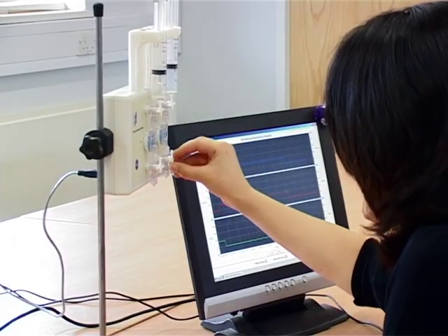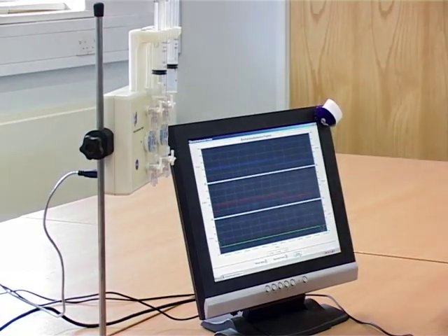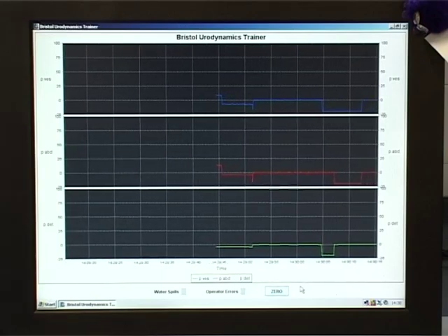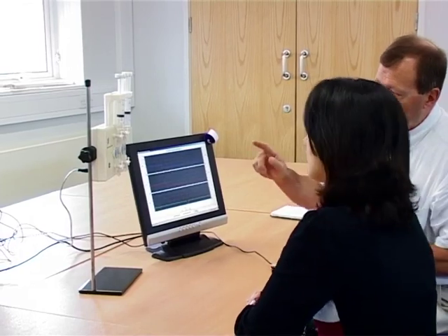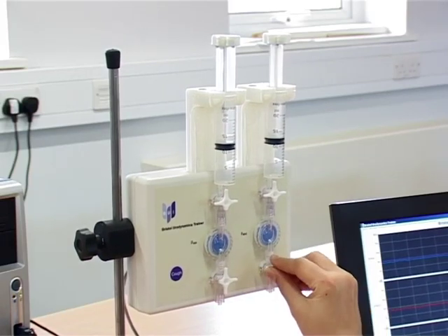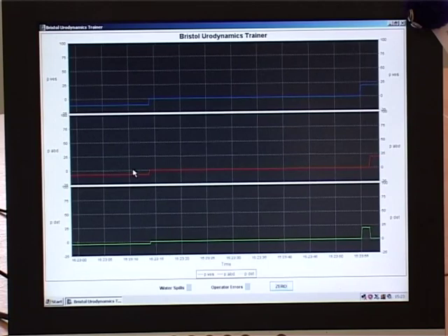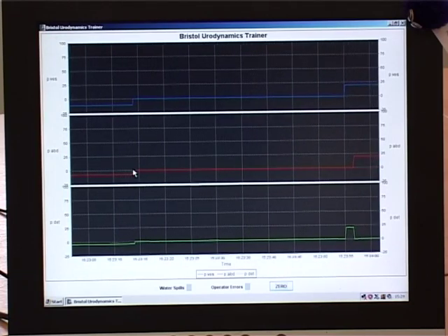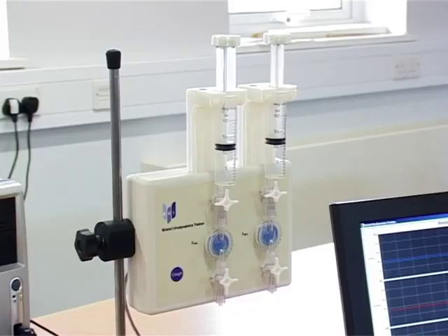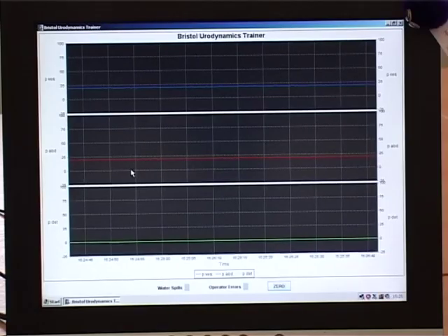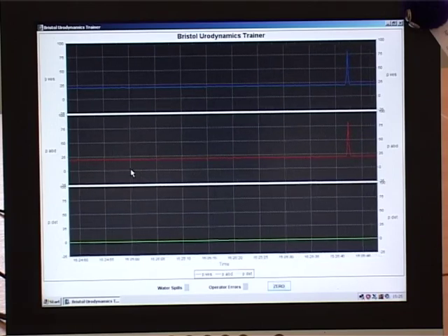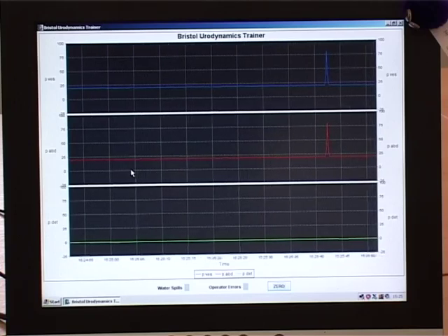The trainee can then be led through the correct zeroing procedure. Once this has been done, a simulation of urodynamic recording can be carried out by opening the taps to the patient. The pressure rises to a normal patient level and a live signal appears on both lines. A cough can now be simulated when the trainee presses the button on the front of the unit. The peaks rise equally, indicating good pressure transmission on both lines.